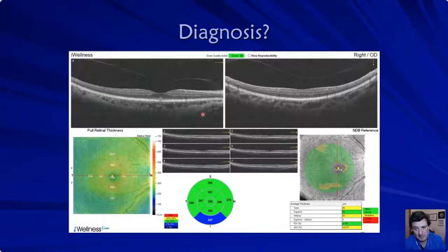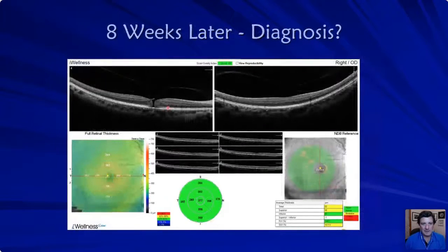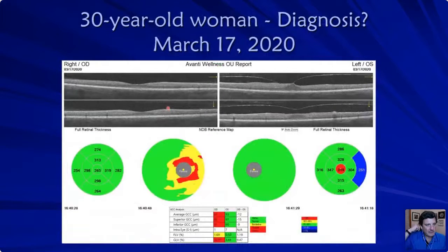And it was just kind of maybe dumb luck on my part, me being a geek, teaching these things all the time, always looking at OCTs. I just didn't like what was happening here. And so I brought him back, and we caught that right there pretty early and got them off to the retinologist. So just fun, and that's why I like teaching these here.